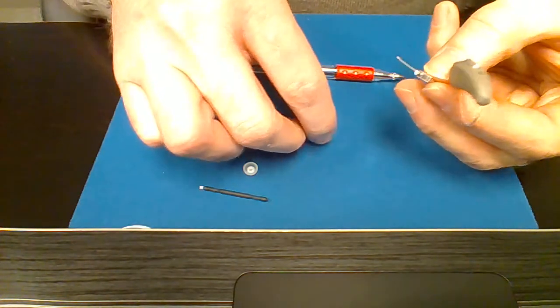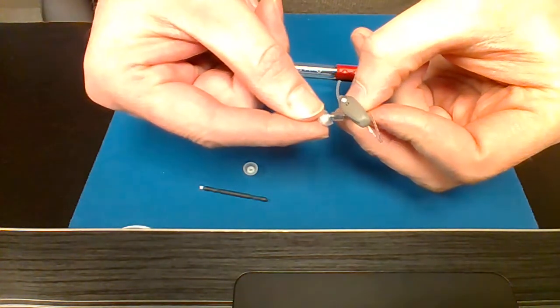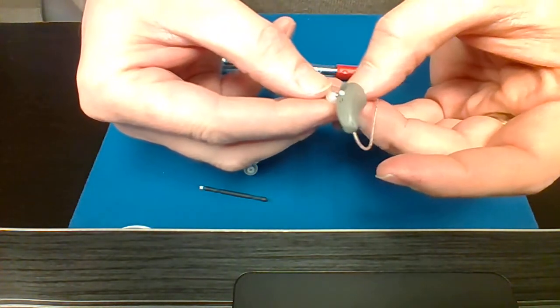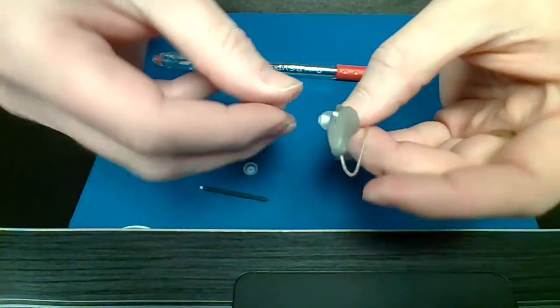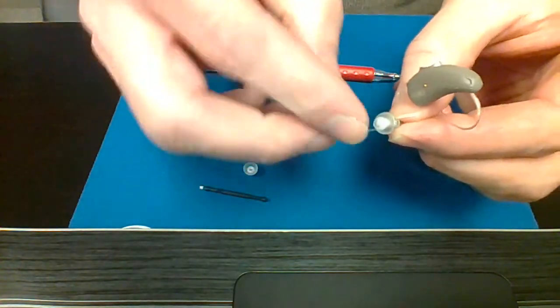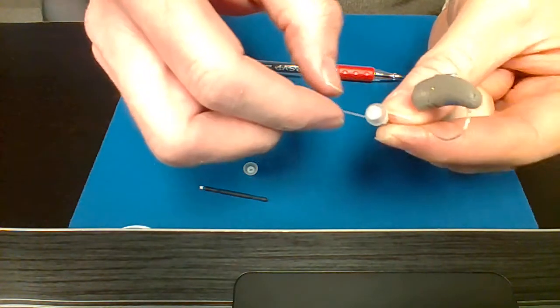Okay, and then you take the new dome, and you put that round hole piece, and you take that little nipple and you put it right inside there, and then it just snaps on, and you'll hear an audible click if you pick that up, or you can feel it just snap on. You want to make sure that's good and secure.